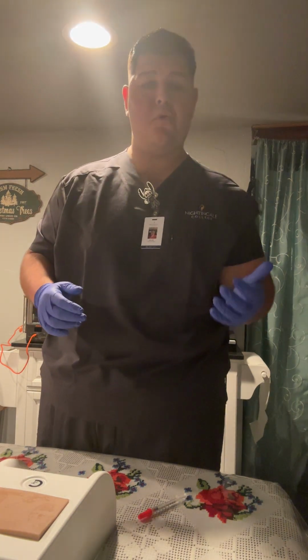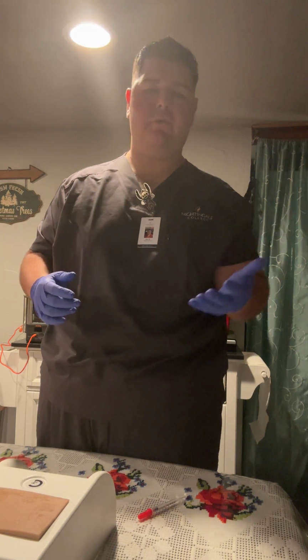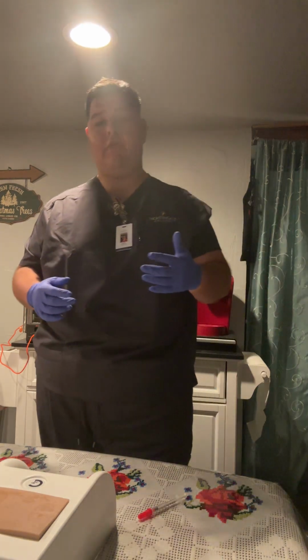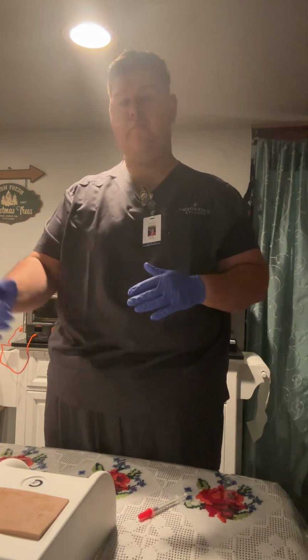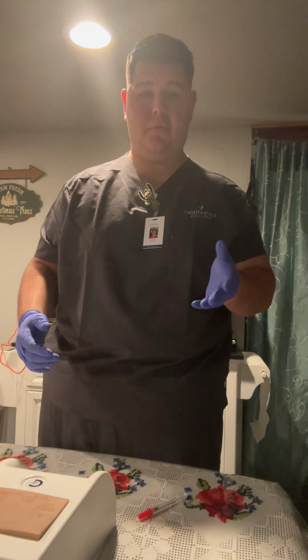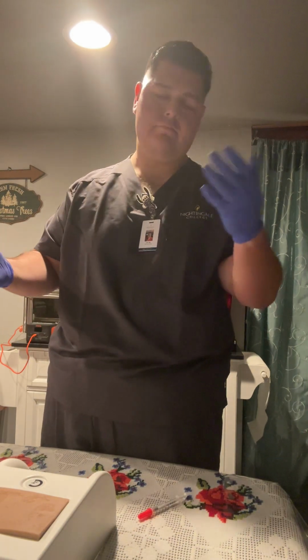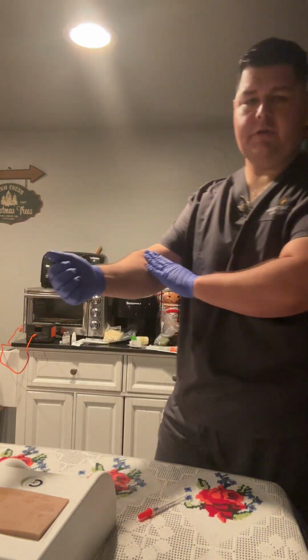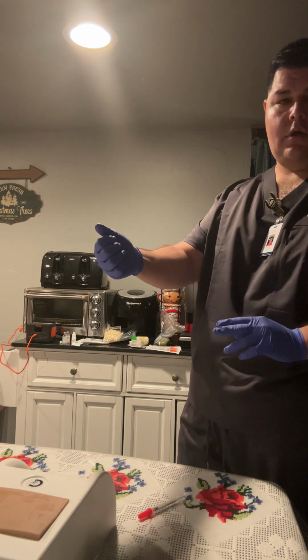I would want to select an appropriate site for the intradermal injection. Typically, you can use the forearm. If that's not the case, the upper back area. So I'm going to show you on my arm here. Typically 3 to 4 inches below the antecubital space, and one inch above the wrist. I don't know if you can see that. 3 to 4 inches below, or 1 inch above the wrist.